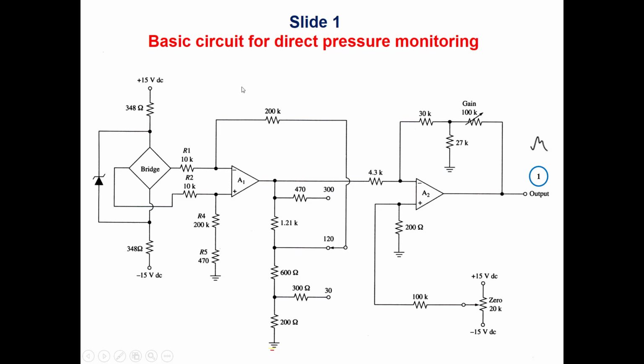Okay, this is the first stage. The second stage, as we said before, prior to start to measuring and recording the blood pressure, we need to make zeroing. So we make this zeroing using this potentiometer. Also another part, so the second part also is a differential amplifier.